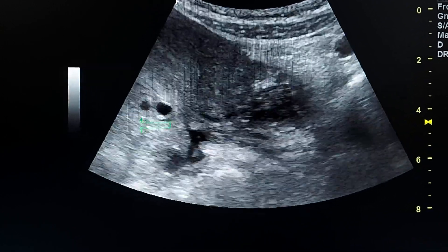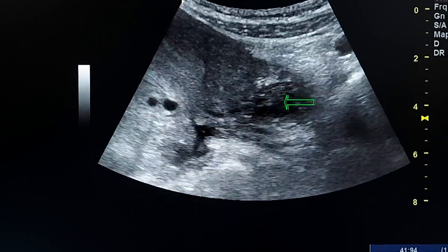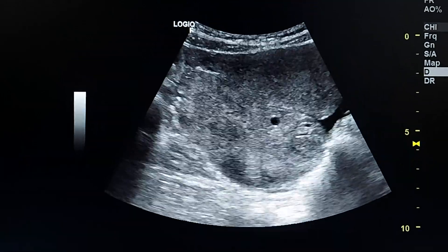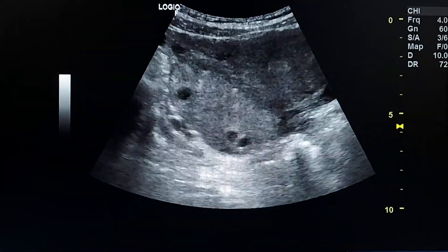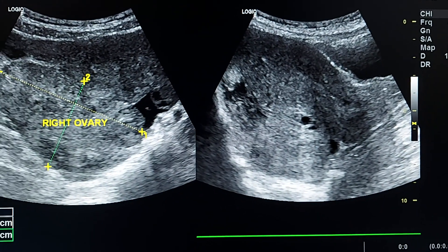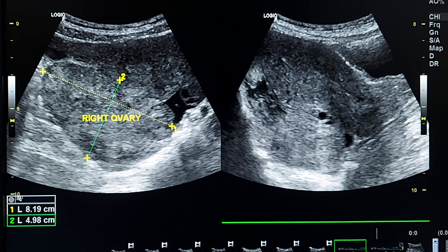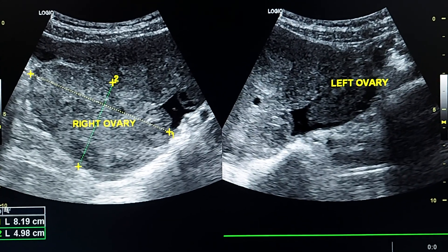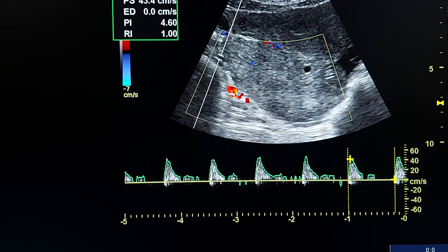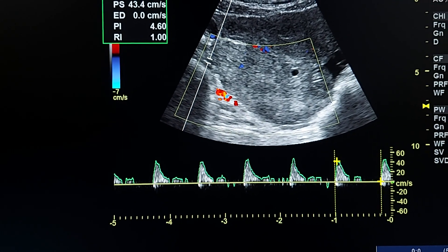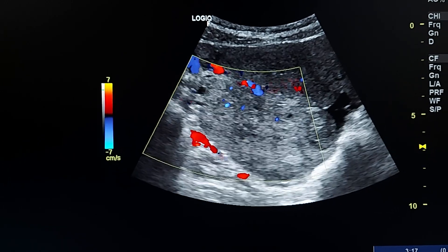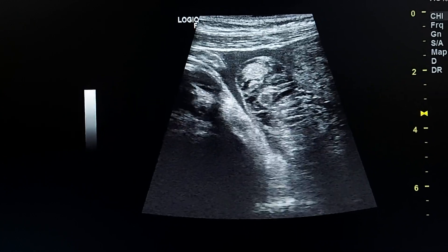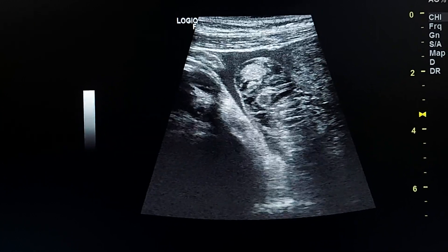Here, this is the right ovary and this is the left ovary, which is normal. The right ovary measures 8 centimeters in length. This is the left ovary. This is the Doppler flow inside the ovary. By linear probe, we see small free fluid inside the pelvis.